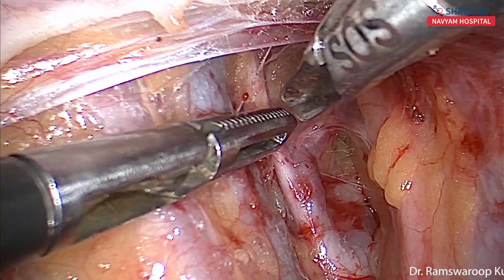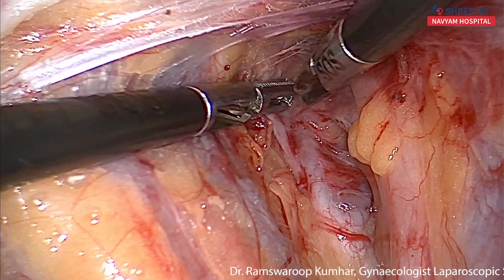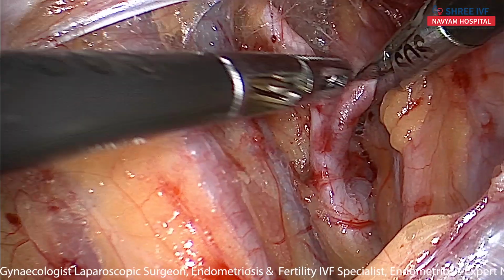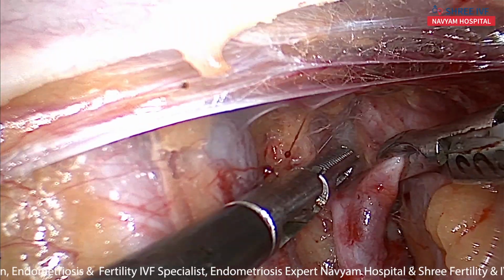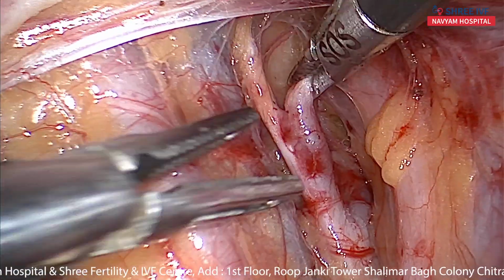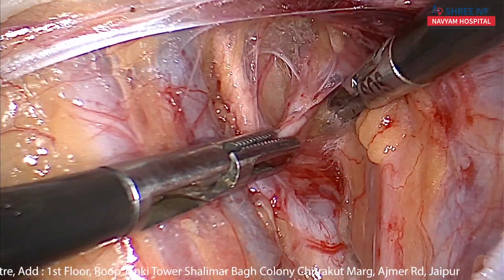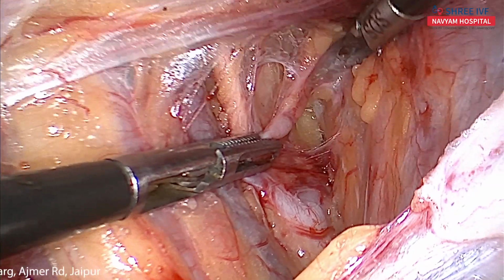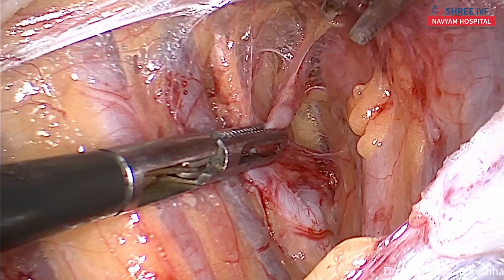Now this is well visualized. Good length of this we have achieved. Slightly more dissection is needed to make the ureter distant and in vision.